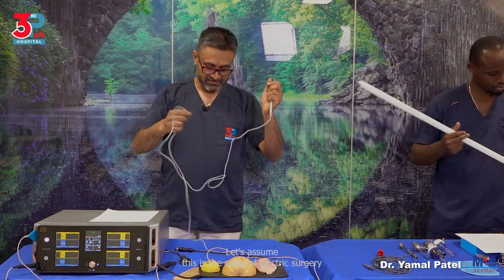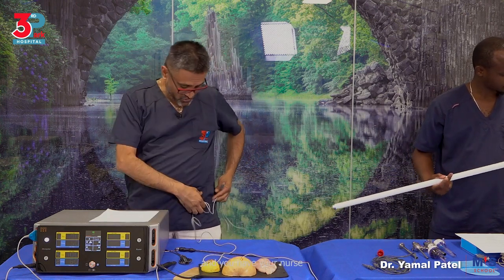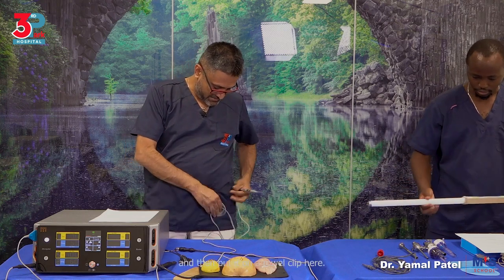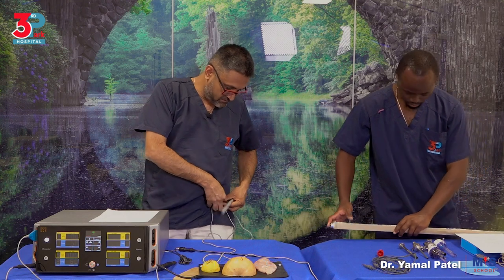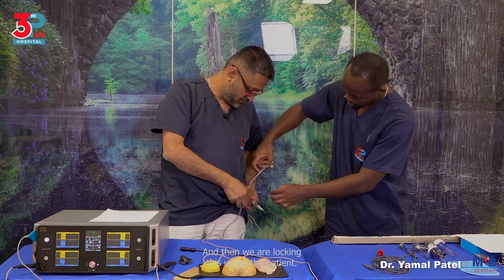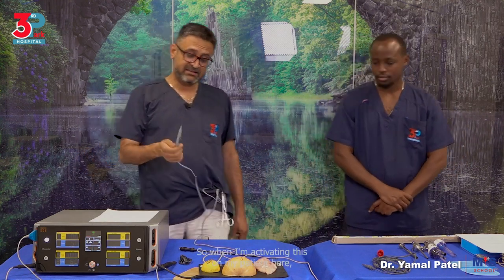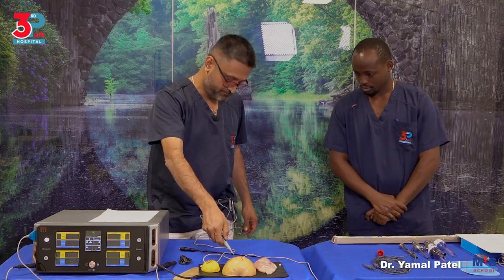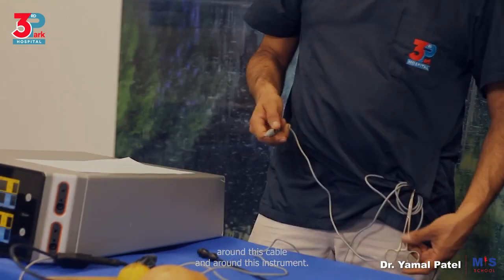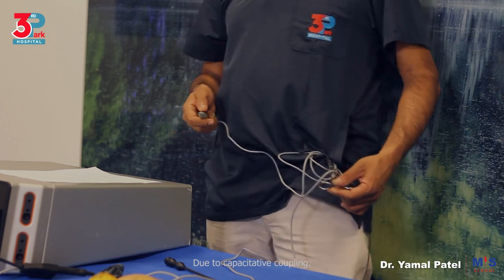Let's assume this is the cable of electrosurgery, and you have your nurse go and wind it up like this, and then put it on a towel clip here, okay? On a towel clip here, and then we are locking this up on the patient. So when I'm activating this on my patient here, there is electricity collecting around this cable and around this instrument, okay? Due to capacitive coupling.